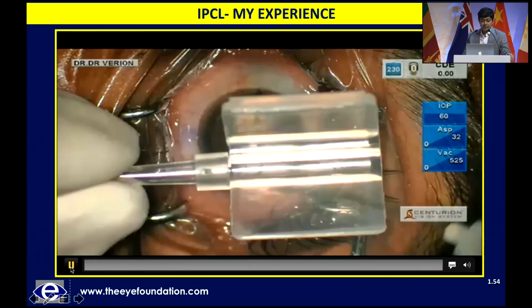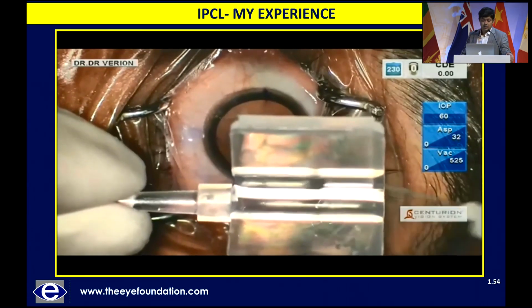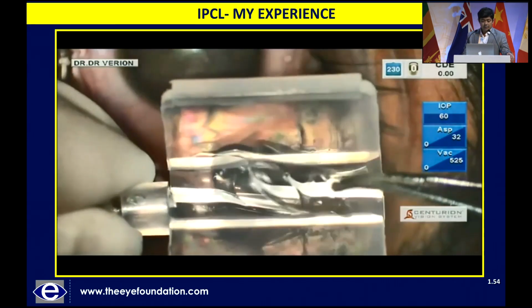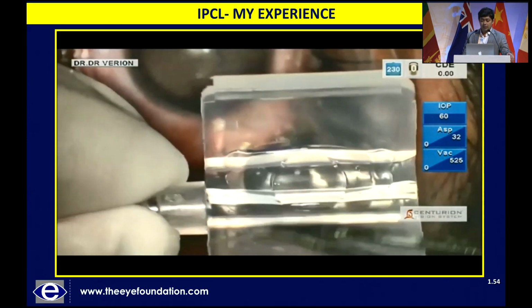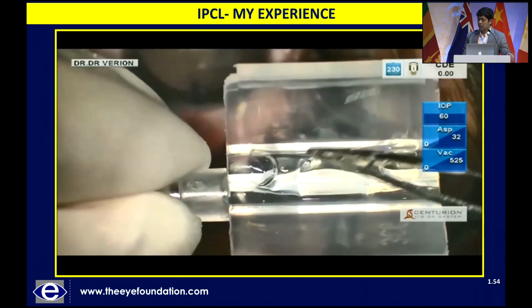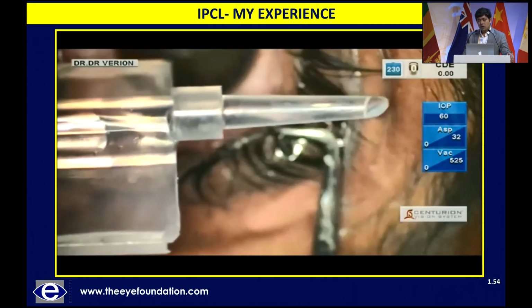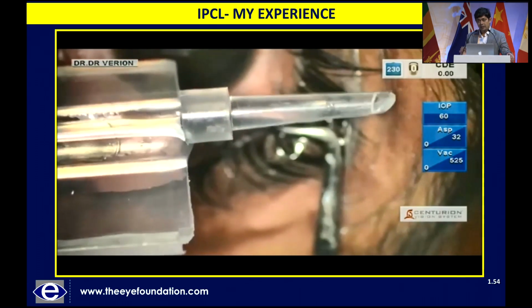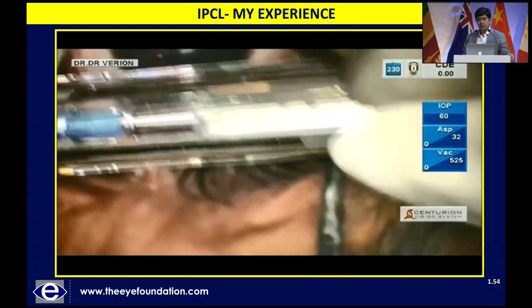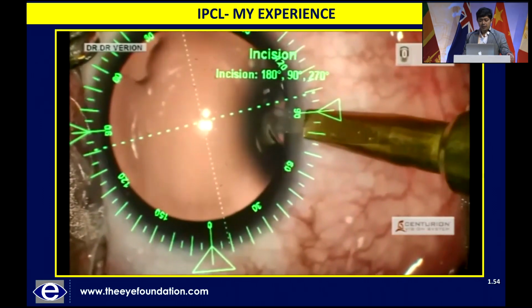The loading of the lens itself is very, very easy, and you can do it with both BSS or viscoelastic, and generally I just do it with saline. It's a simple butterfly cartridge: place it in the center, press it down, and while you keep it pressed down, just close the cartridge. This is important because you don't want any of the soft pads to get caught in the cartridge when you're closing, because that can lead to a tear of the lens when you're trying to push it. Apart from that, injecting and placing is very, very simple.